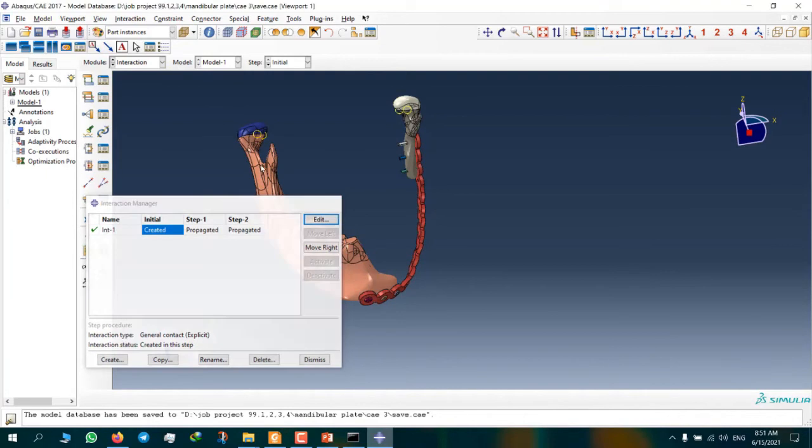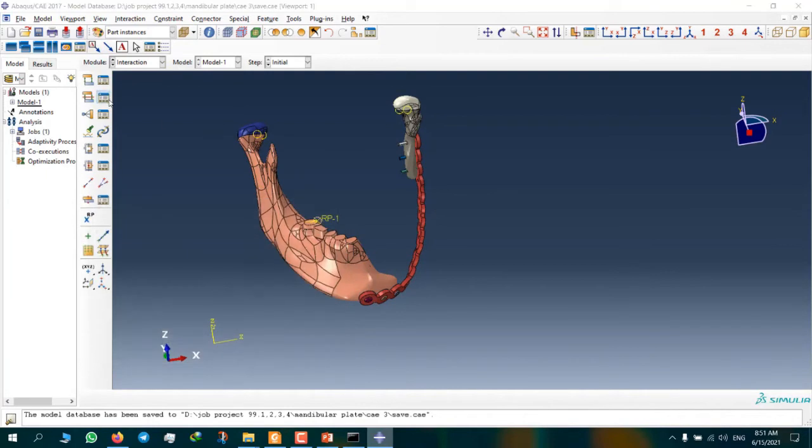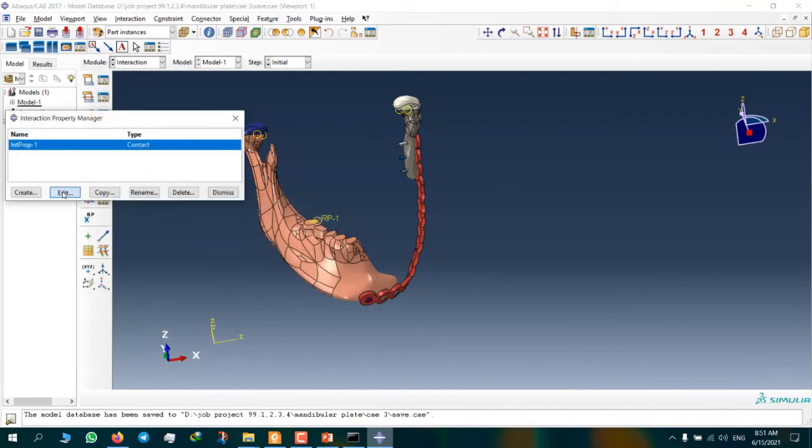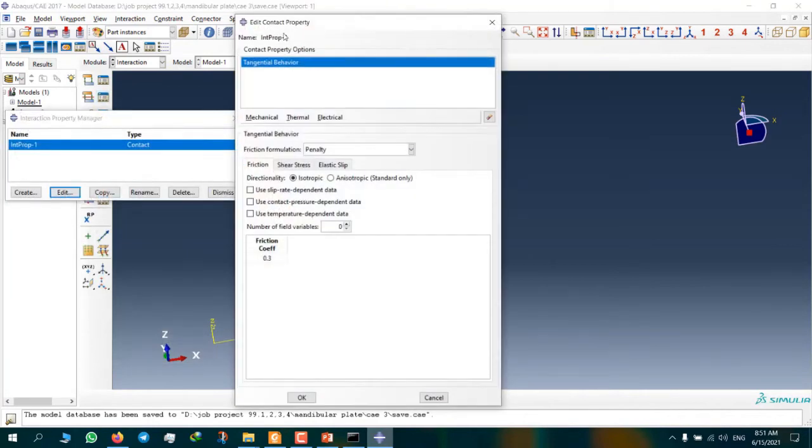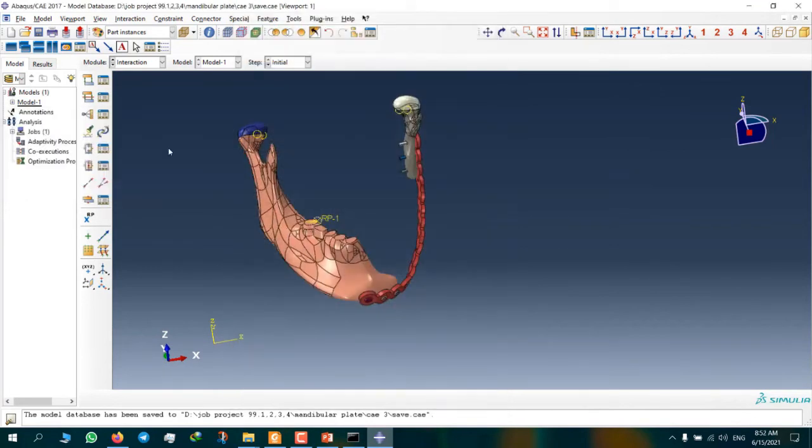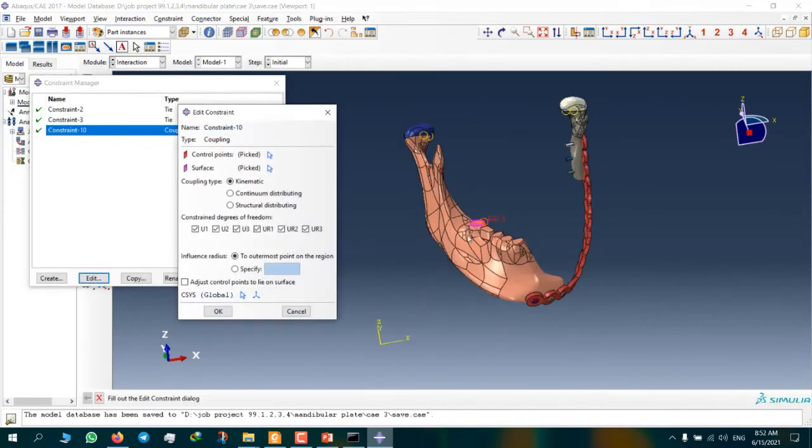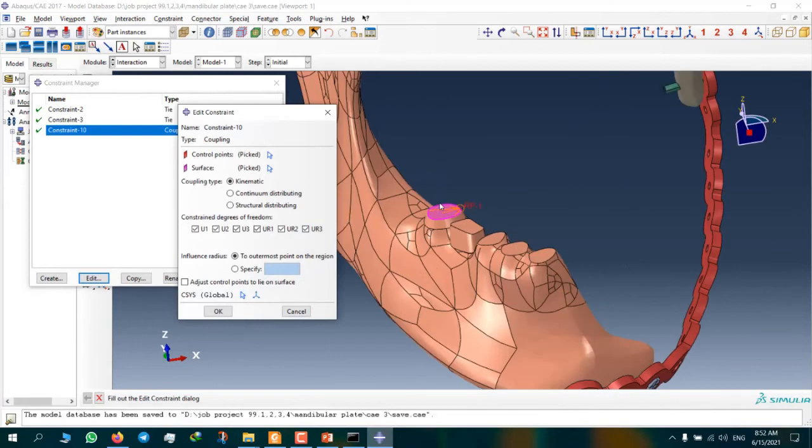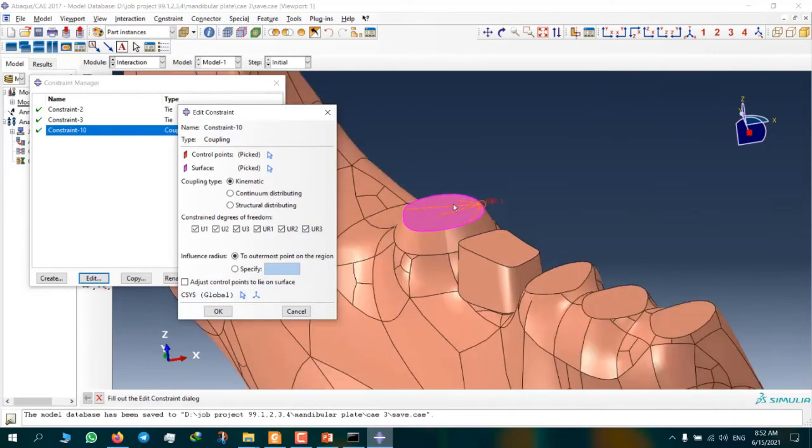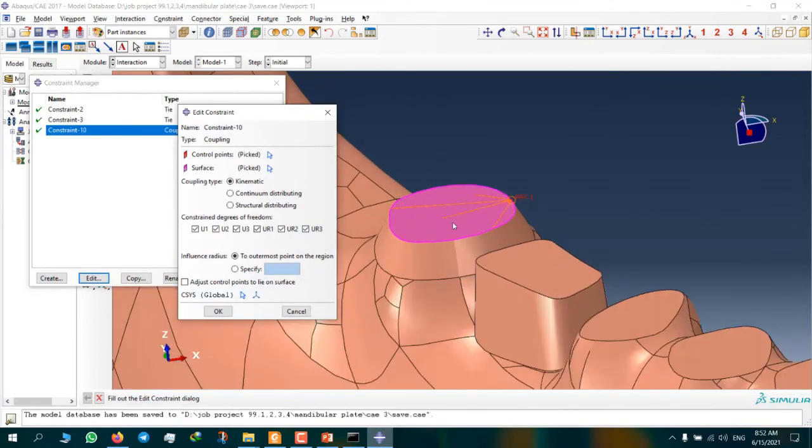And this is our contact. Friction coefficient is 0.3. And here we have coupling, reference point on molar teeth. This is for loading.